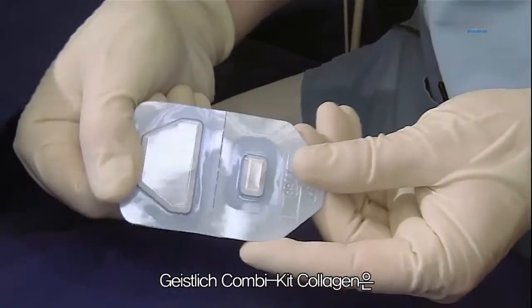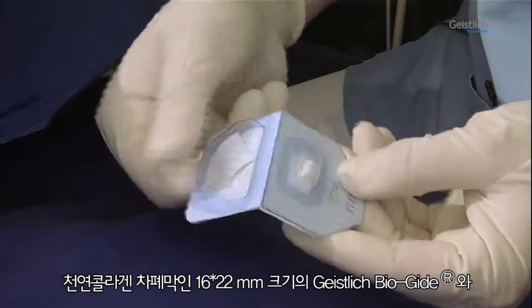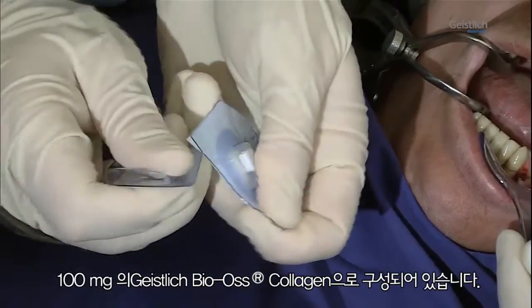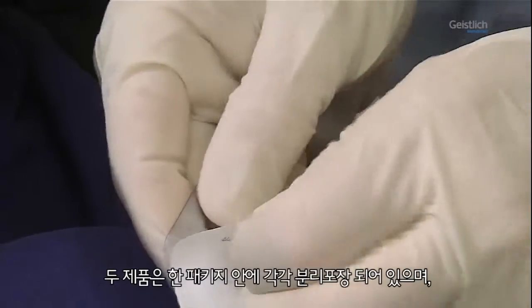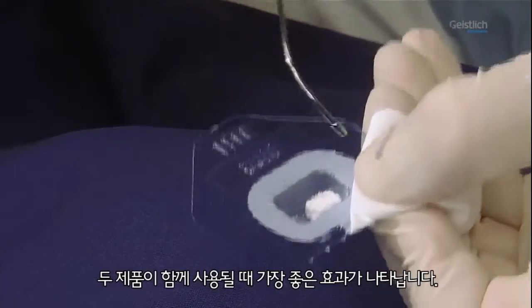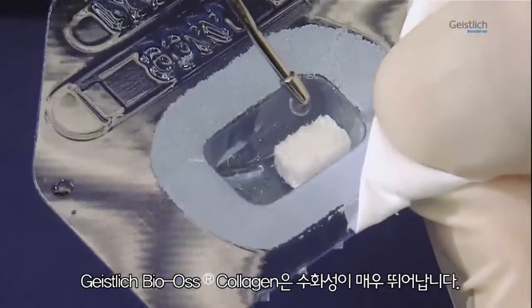The Geistlich Combi-Kit collagen consists of a 16 × 22 mm Geistlich Bio-Gide collagen membrane and a 100 mg Geistlich Bio-Oss collagen block, which are individually packaged in sterile blisters. Both products should be used together in the same procedure. The Geistlich Bio-Oss collagen block absorbs liquids well.